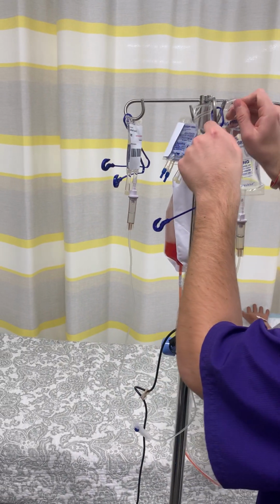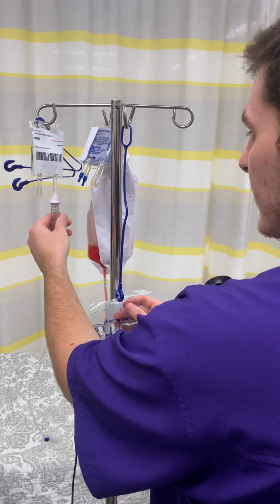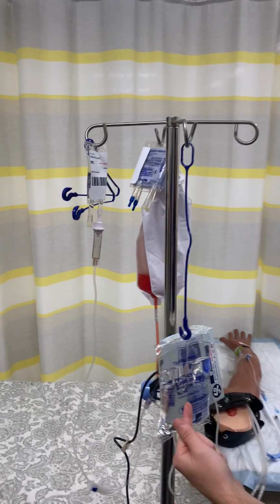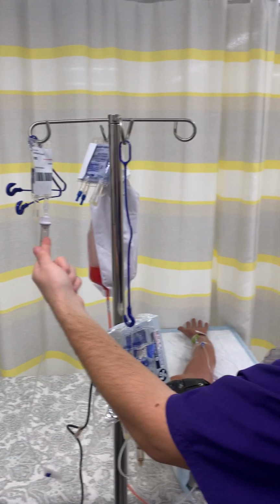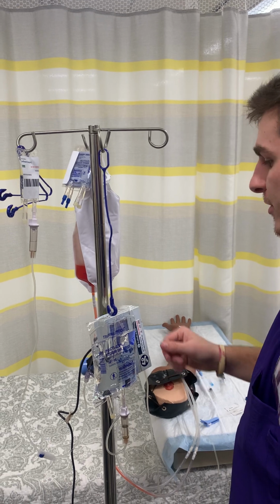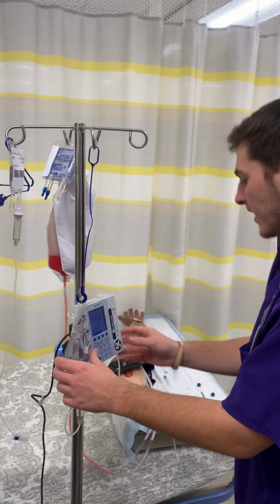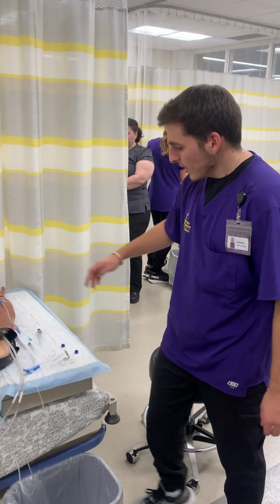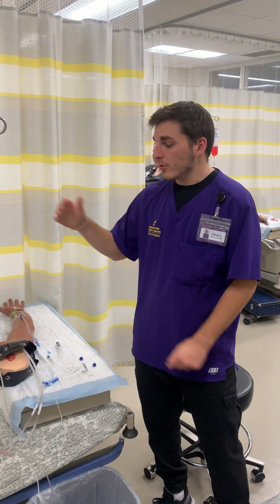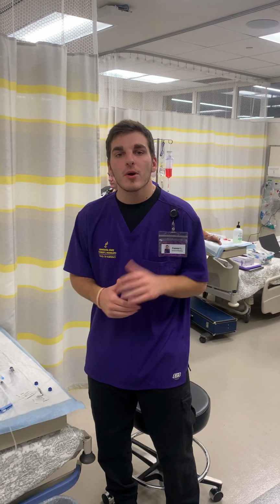And before we do that, we have to make sure that this bag is lower, so then this will start dripping. As soon as we bring this down, this started dripping. And then we know that now this is going to infuse, and then this bag will start to infuse after that. So now that we have everything ready, I would pick up all my items and I will leave our patient in a very comfortable position. I will document on the board.